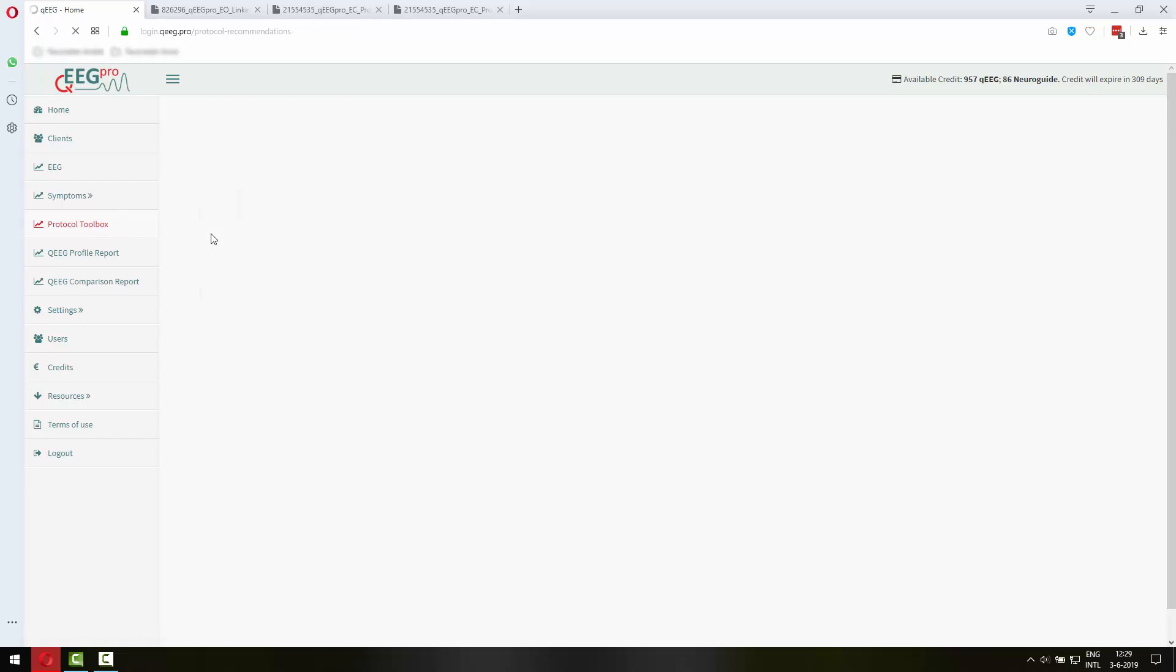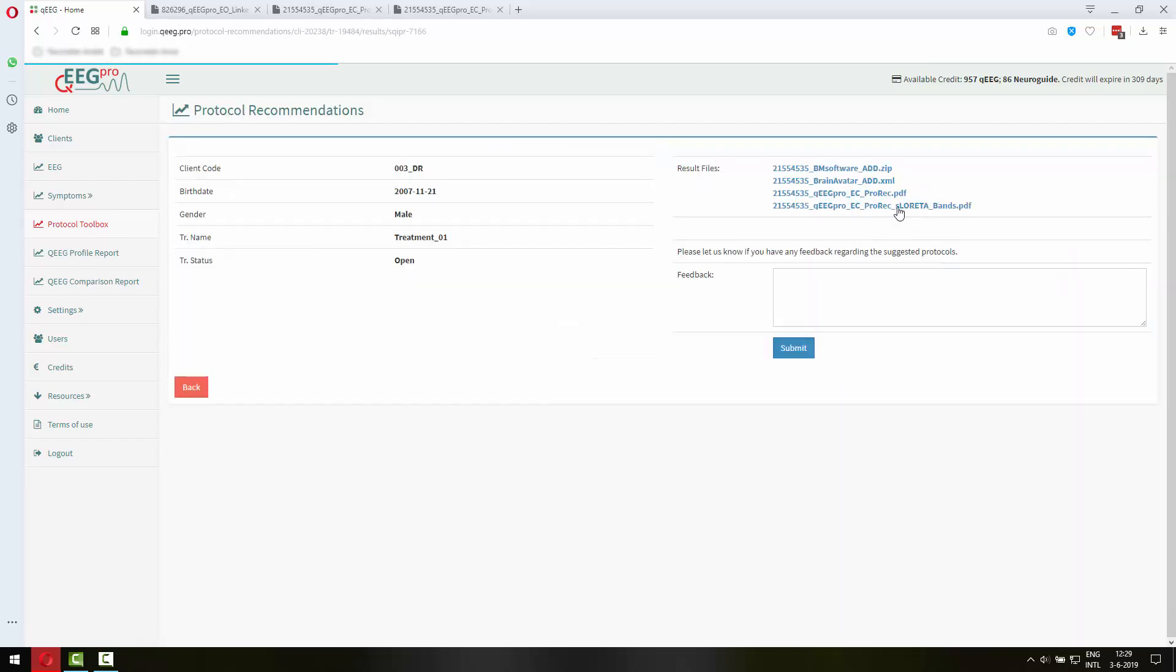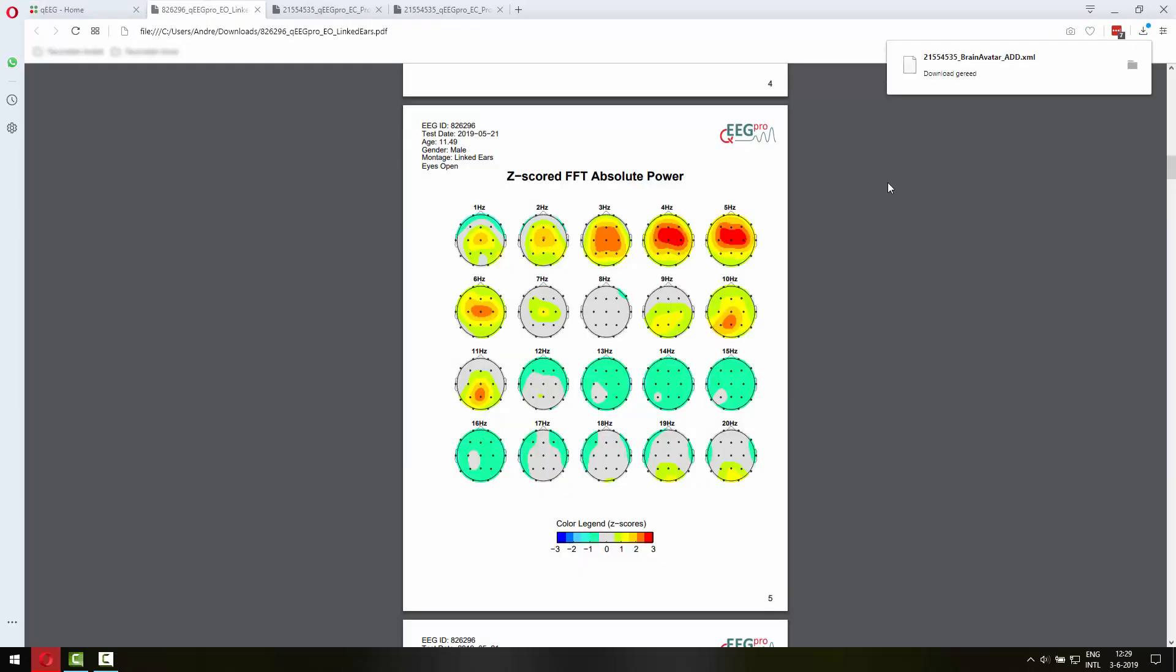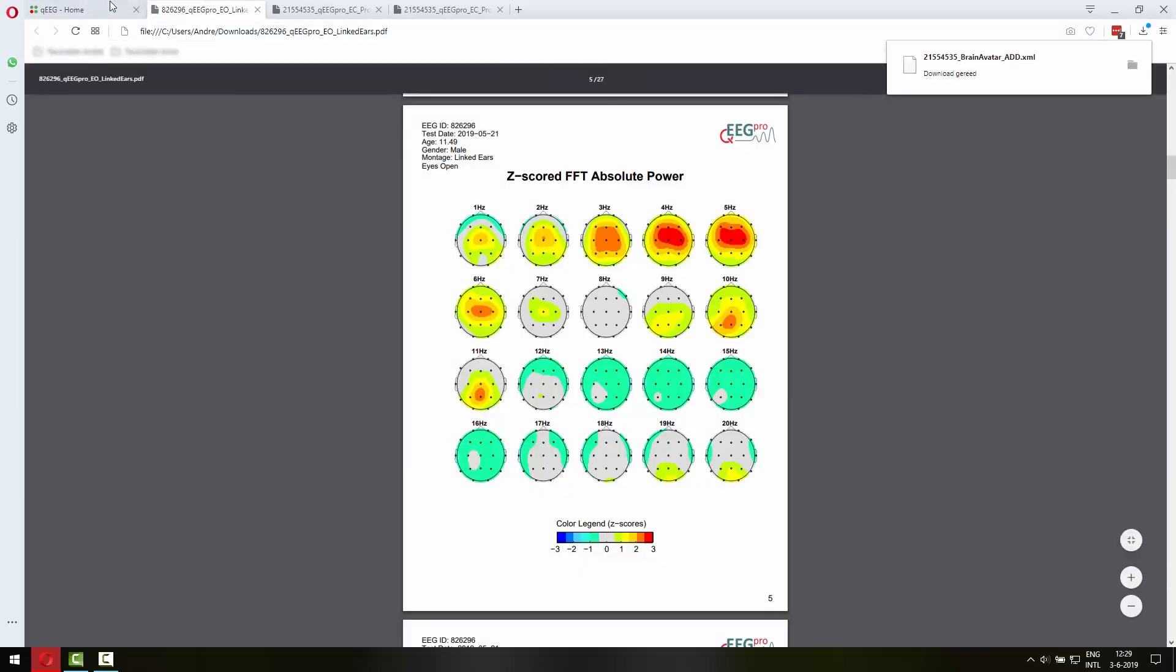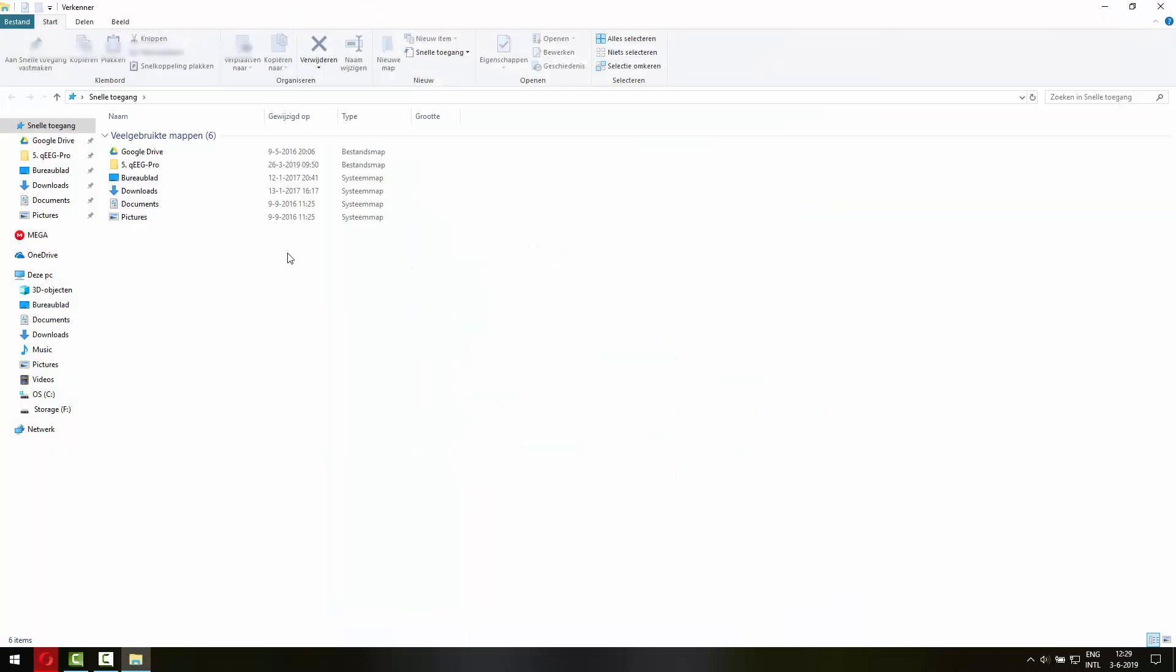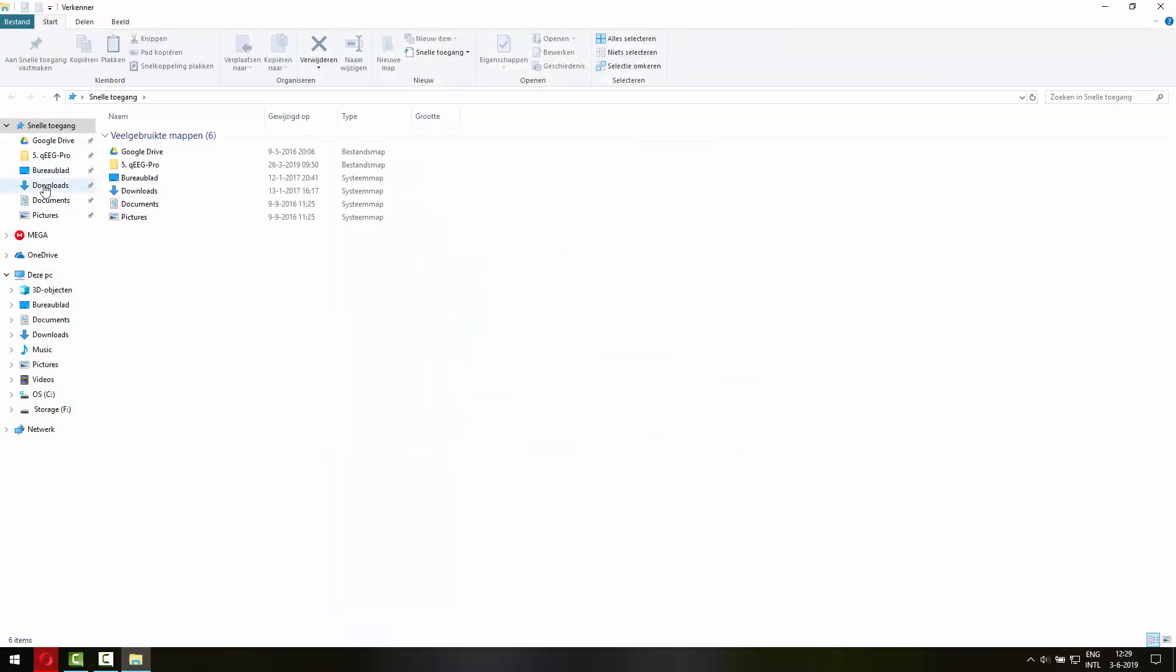Let's get back to the results here. So the XML file is for the Brain Avatar software for doing sLoretta live Z-score training and the .zip file is for the classic neurofeedback software, the 3.x software from Brain Master. So let's download them both. Let's go to the download folder. And here you can see the reports and the two files that I just downloaded, the settings files.